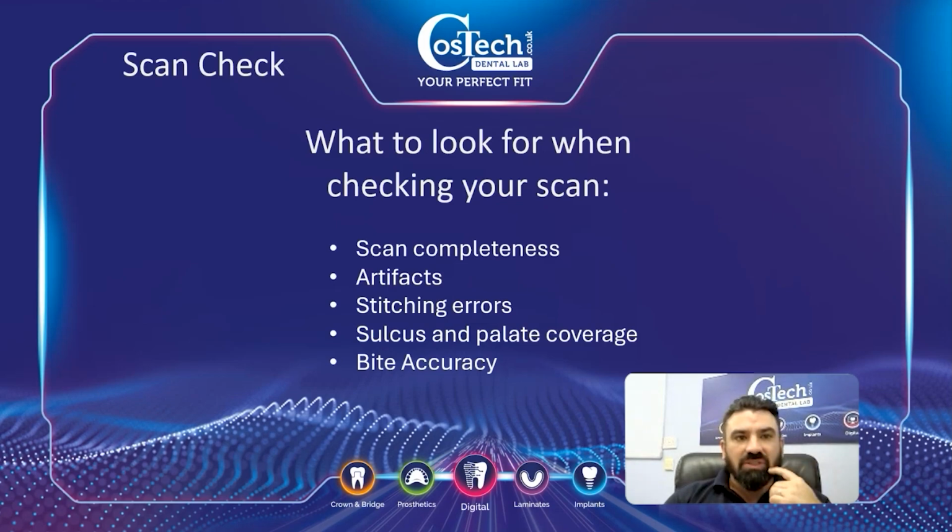So when you've done your scan and you're about to send it to the lab, these are the main 5 things that we're looking for. The first thing is scan completeness. Data holes: with crown and bridge, you can get away with a certain amount of data holes because it might not be in a relevant area. But with dentures, it's very imperative that we have a good scan there.